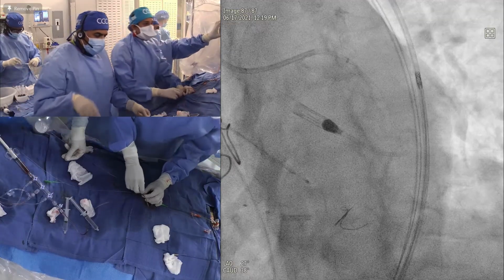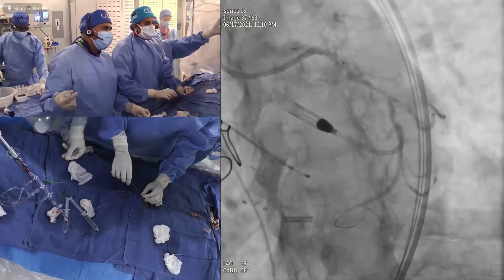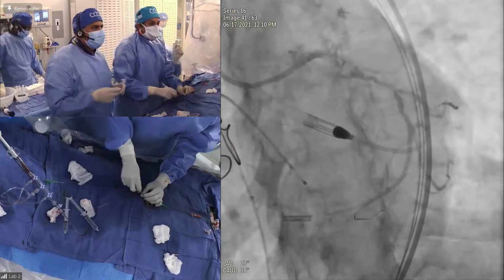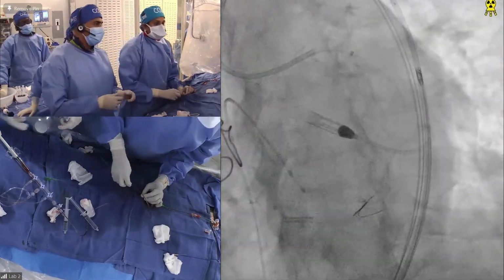Maybe it's by the virtual versus what? We can just show one second. Here. Yeah, here. See that? Exactly where it originates. There is definitely a dissection there. I wouldn't do that. Exactly. Yeah, proximally. Yeah. Gutter, yes. Okay. The patient characteristics too, extreme elderly.